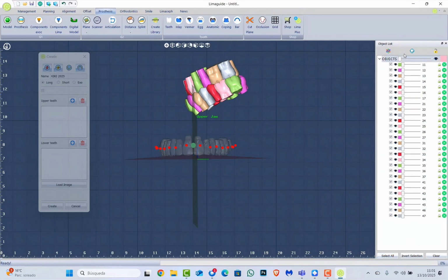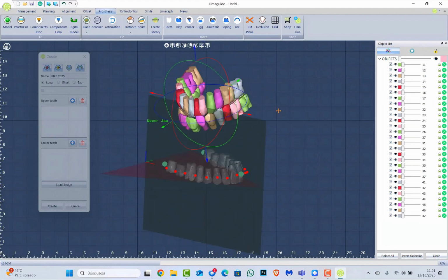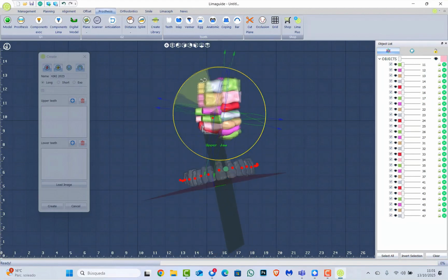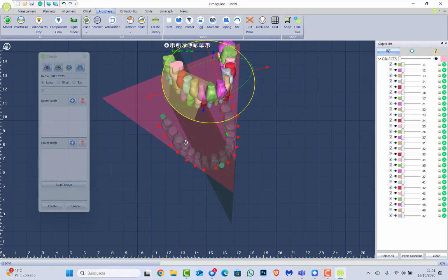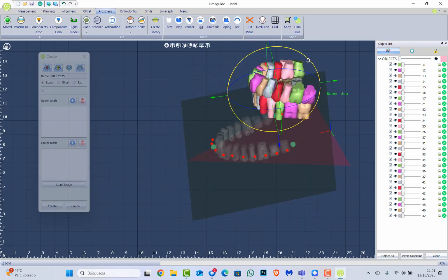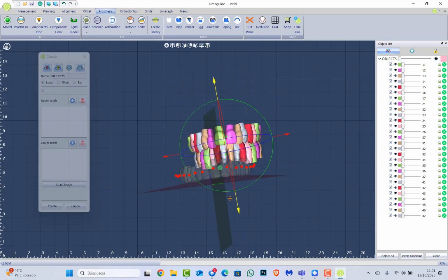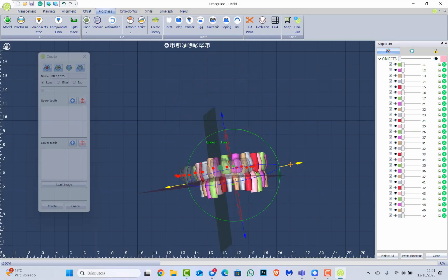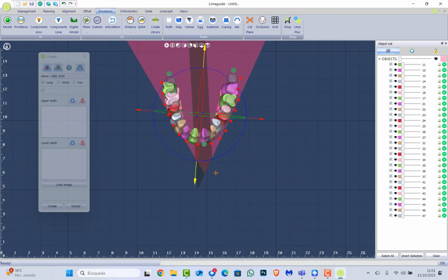So I'm going to select all, then click on the atom. And if I also press Ctrl, I can move the axis without moving the pieces. So now with this, I'm going to rotate all the pieces together. I am going to rotate it a little more. Then just put them down and make them fit exactly where the blueprint is.